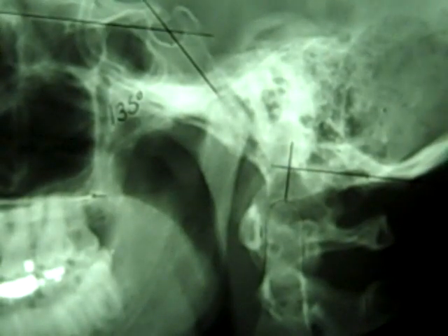All right, so on this page we have 4 processes to find platybasia. We have basilar angle, McGregor's, Chamberlain's, and McRae's. Of these 4 methods, McGregor's is considered the most universally accepted. The most universally accepted means that you'll find other healthcare providers use it, and it's used in courtroom testimony, depositions and research papers, but you'll run into it a lot more often than you will any of the other methods. Again, McGregor's is the most universally accepted.